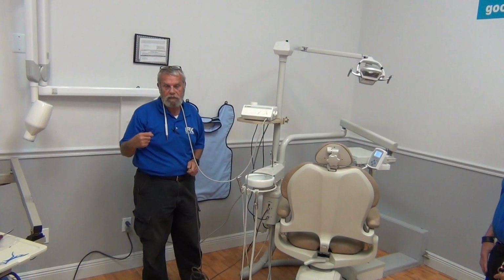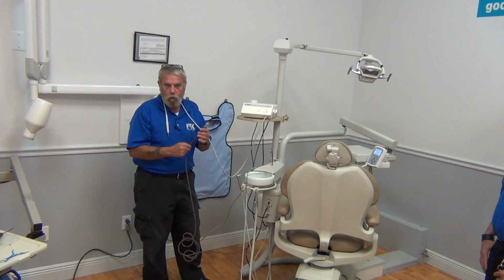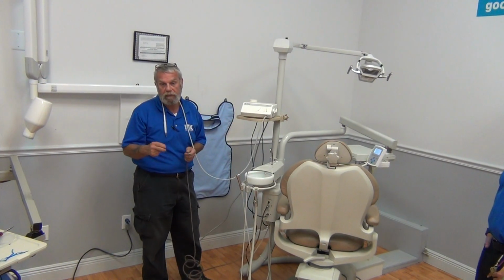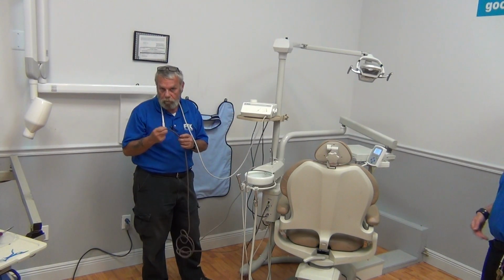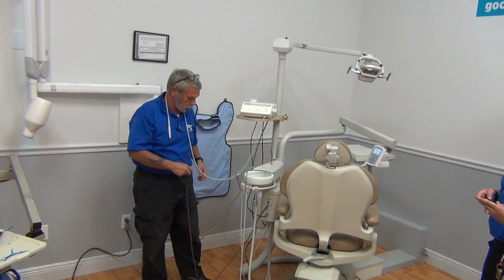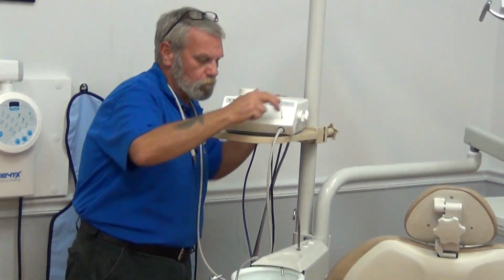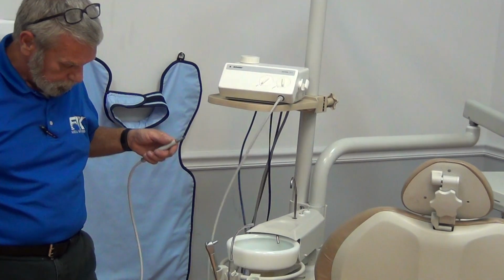Everybody knows what biomass is? It's the funk that grows in the line. You have a 1/4 inch stream of 40 to 60 psi water regulated down to a 1/16 and an 1/8 inch stream. You're going to get mildew or biomass backing up in it. So be patient, you can clear the lines out. We'll reconnect the air. We'll give the unit a quick test.